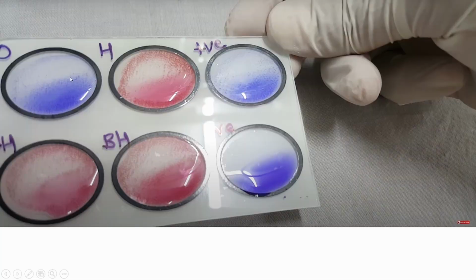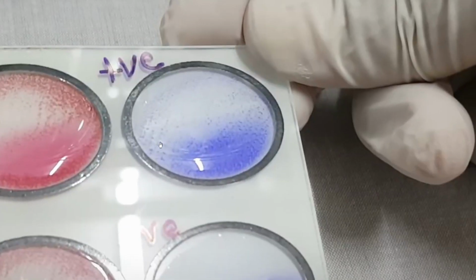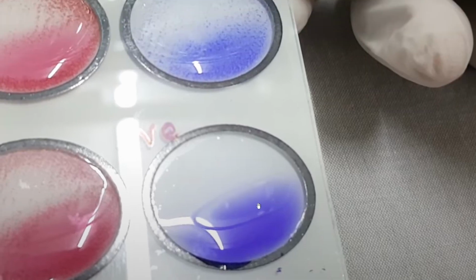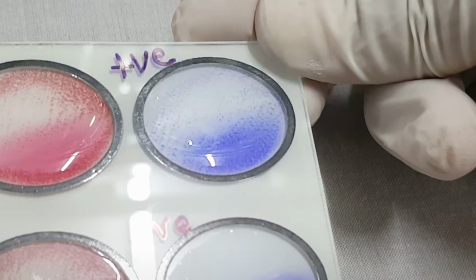What is this? This is the positive control, this is the negative control. Leave all this, you just see this one and this one. What do you see? Here you can see small dots. Essentially this is nothing but the clumping. The agglutination has been formed here. Here nothing, very smooth. So there is no clumping or agglutination here, there is agglutination here.